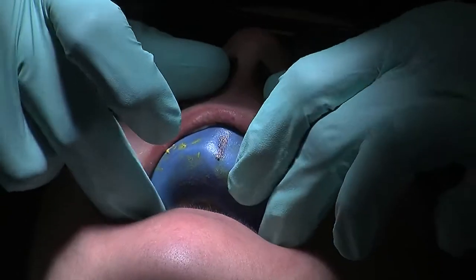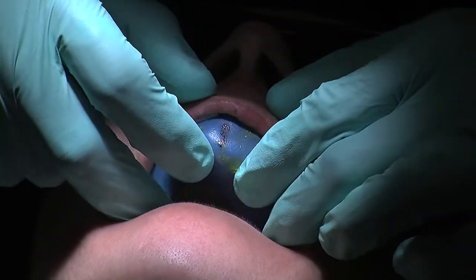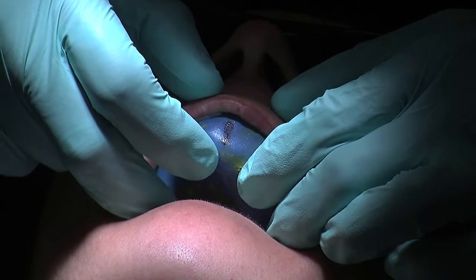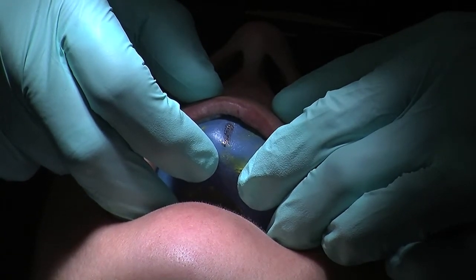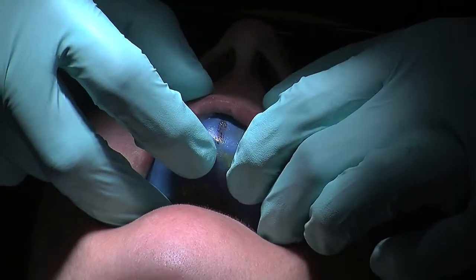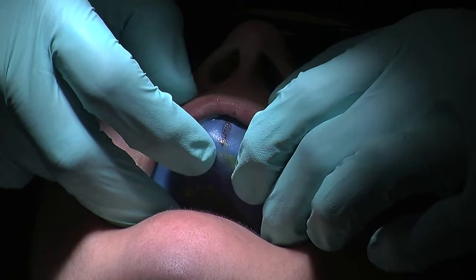Just relax your lip. And we'll use that mark so I know I'm fully seated. I can feel positive pressure, it's firmly seated, and I'm going to hold this in place nice and tight now. That's the key thing. And you need a good amount of putty in the palate so that there's no movement anteroposteriorly of the putty index at all. So with 4 fingers, there's fairly firm pressure holding in place now for a good 2.5 minutes.